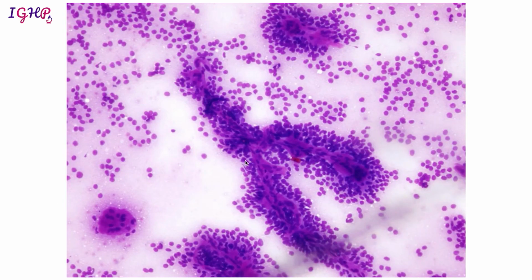Now from the lesion that we have described, if we are getting fragments like this, as opposed to the mucinous background that was seen with the previous case in which the papilloid fragments were present, here again we could make out that there are many papilloid fragments, but the background is not mucinous. Rather, the background here is showing numerous bare nuclei which are similar appearing. So there are numerous small nuclei which appear monotonous, likened to each other, and many of them have round nuclei with finely vesicular chromatin.